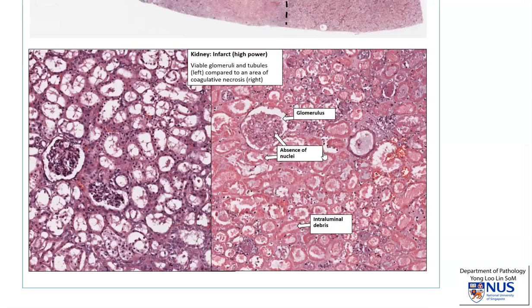When we look at high magnification, we can see a direct comparison: on the left is a normal, live, viable renal cortex with some glomeruli — we can clearly make out the nuclei. And here on the right is a portion taken from the infarcted area, and we can see that the glomeruli have lost their nuclei. Also, the tubular epithelium appears much more eosinophilic with loss of nuclei. This is classical for coagulative necrosis.